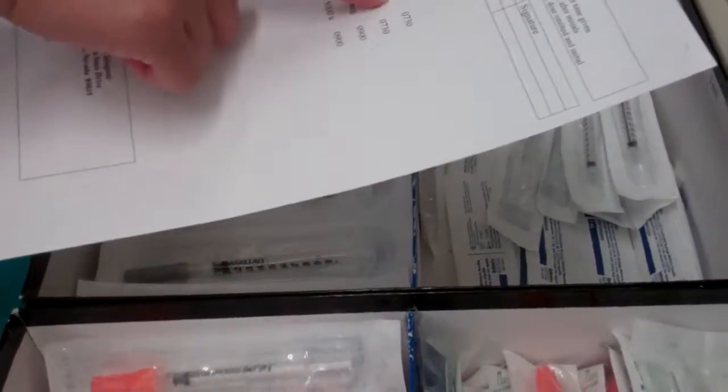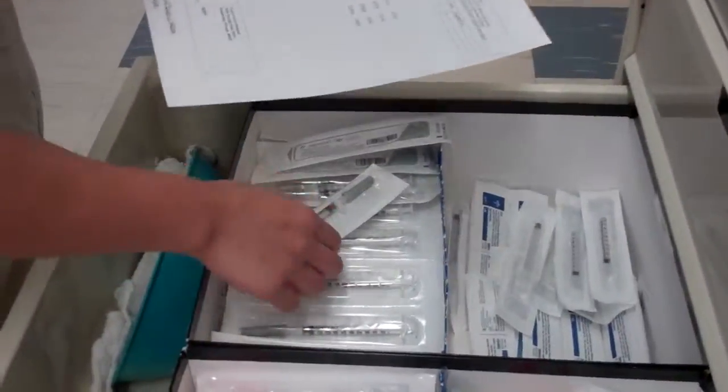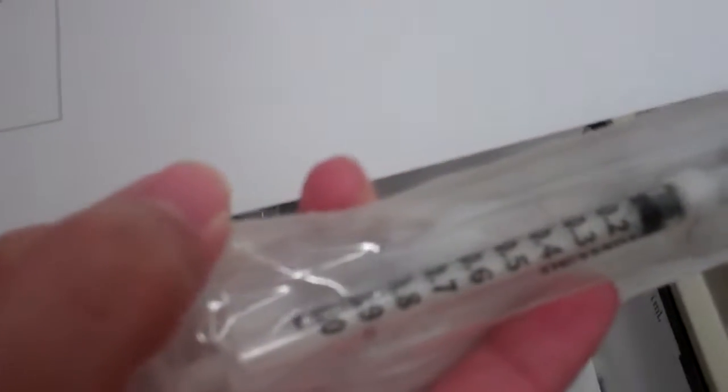For my insulin, I'll be giving a total of 8 units plus a 35, so I'll be giving 43 units in total. Since it is 43, it's still less than 50, so I'll be using the 50 insulin syringe, half ml. And since I need 1 ml for Ansef, I have the 1 ml syringe. And then for heparin, I'll be giving half, so I'll also need a 1 ml as well.